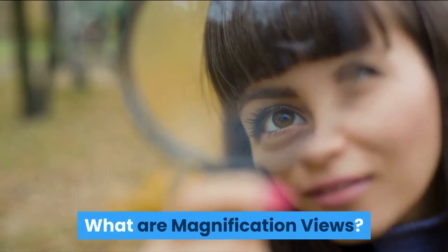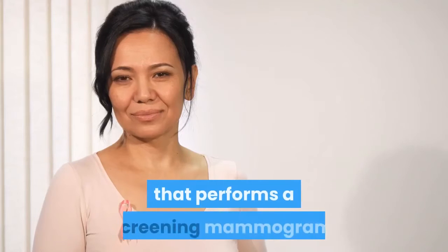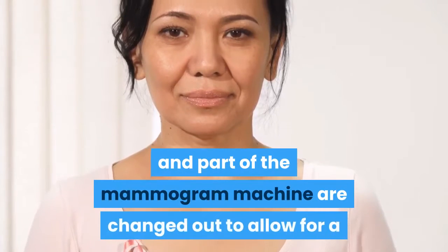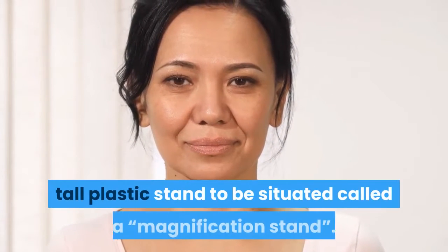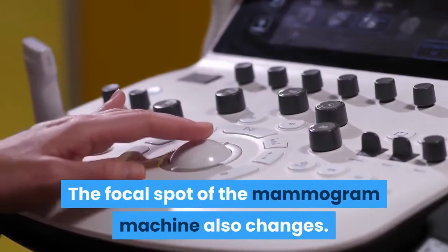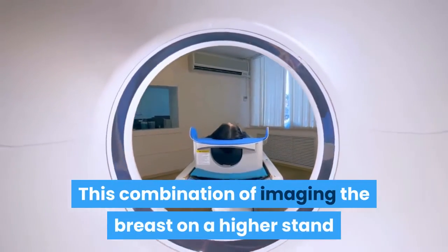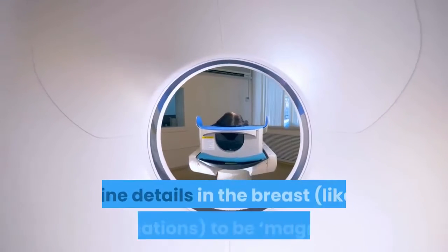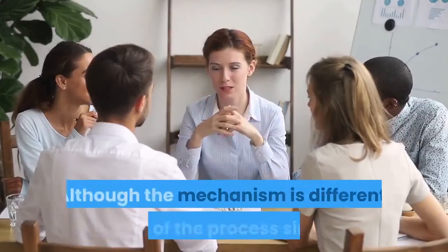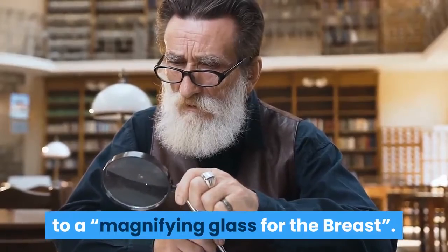What are magnification views? These special mammogram views are performed on the same mammogram machine that performs a screening mammogram. However, the regular plastic paddles and part of the mammogram machine are changed out to allow for a tall plastic stand to be situated, called a magnification stand. The focal spot of the mammogram machine also changes. This combination of imaging the breast on a higher stand and changing parameters of the machine allows fine details in the breast, like calcifications, to be magnified. Although the mechanism is different, think of the process similar to a magnifying glass for the breast.